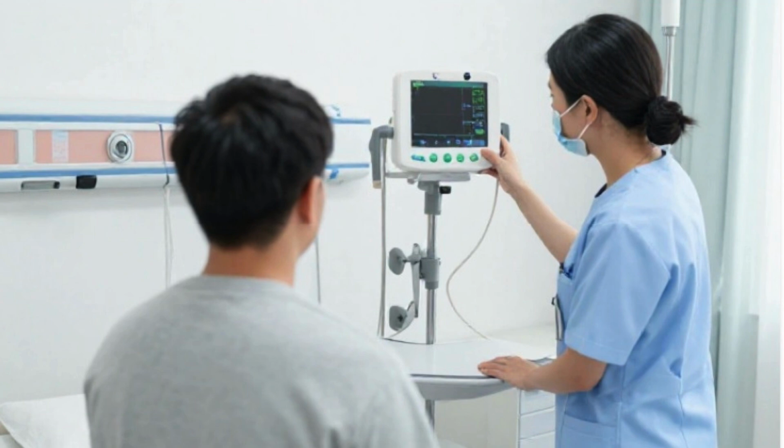Similar to ECG machines, patient monitors deal with very small electrical signals that must be amplified before analysis. Signal processing techniques are used to filter out noise caused by patient movement, muscle activity, or electrical interference from nearby equipment. After processing, the data is displayed on the monitor screen.